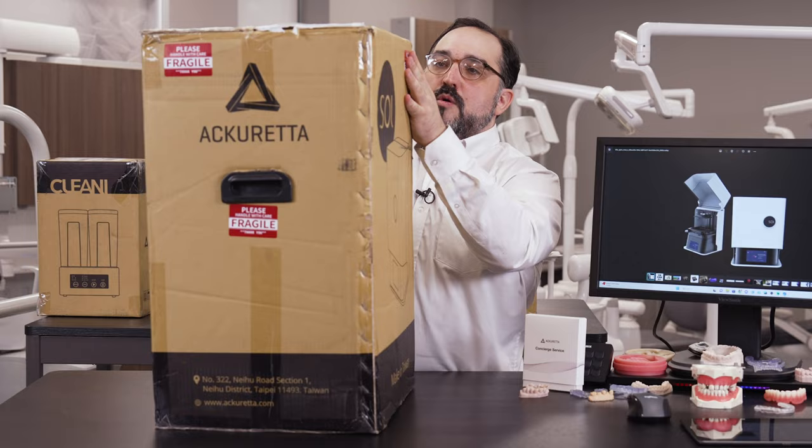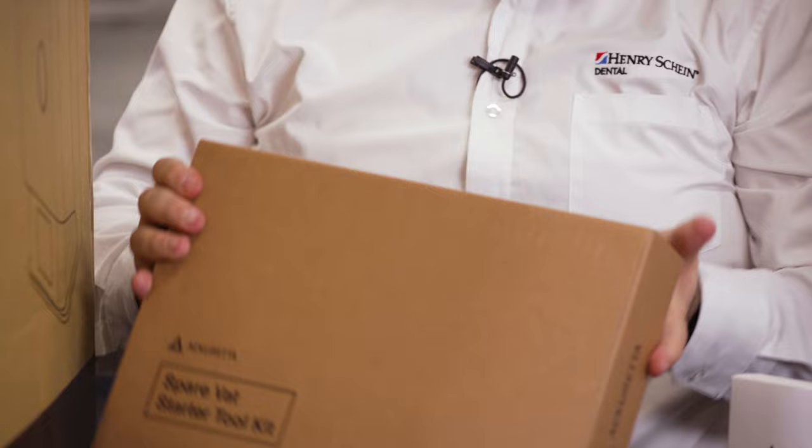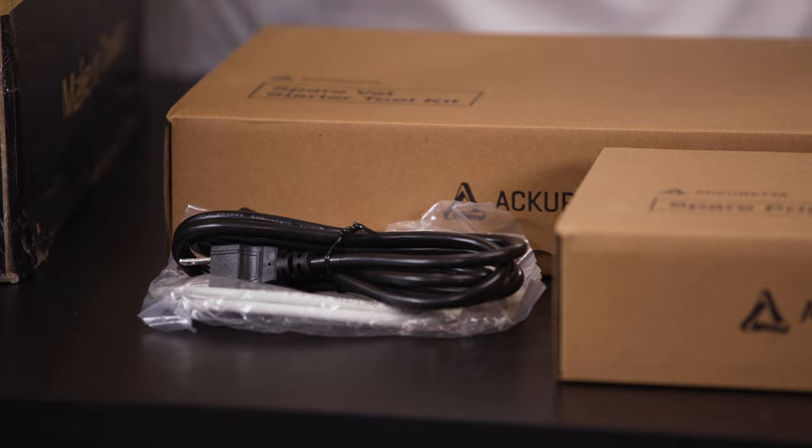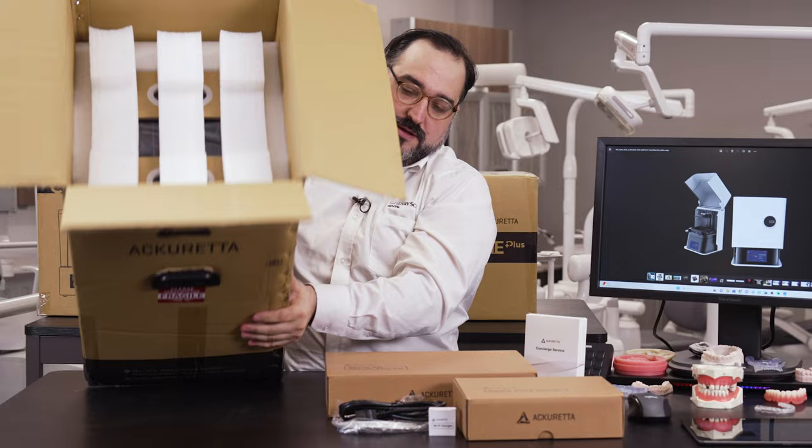So what's in the box? We've got our spare parts, a spare vat, and a toolkit. Then we've got the power cable and a WiFi dongle — which means WiFi is not integrated. I'm not sure how I feel about that, but we're going to keep moving. And then we've got the printer itself.